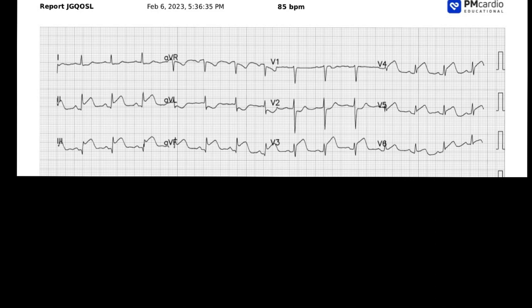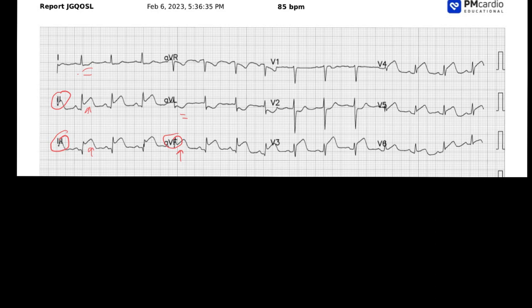Let's go ahead and analyze this 12-lead ECG using our standard systematic approach for interpreting 12-leads. We see ST elevation in leads 2, 3, and aVF. So far, this seems very consistent with an inferior wall STEMI involving the right coronary artery. We also see some depression in leads 1 and aVL — the high lateral leads — which we would expect to be reciprocal. That is even more compelling evidence that we are, in fact, dealing with an inferior wall STEMI.